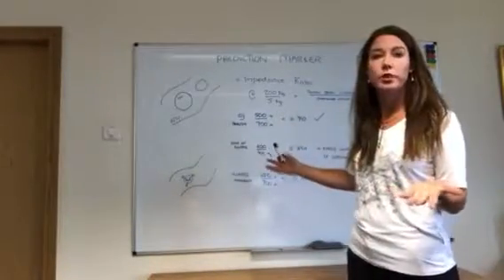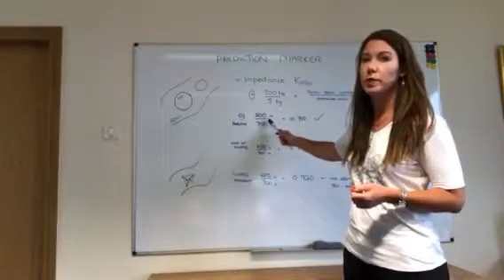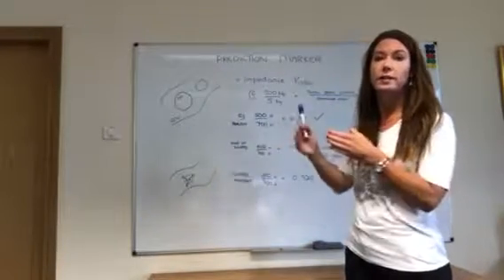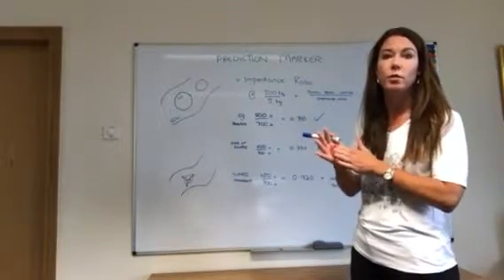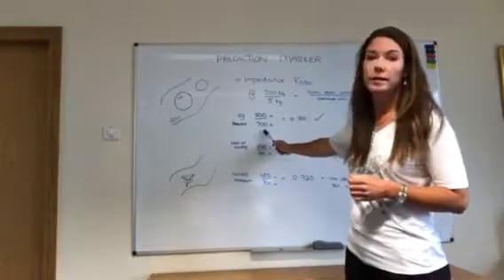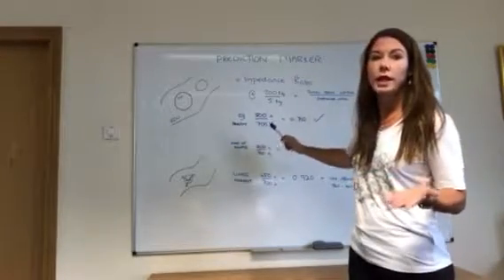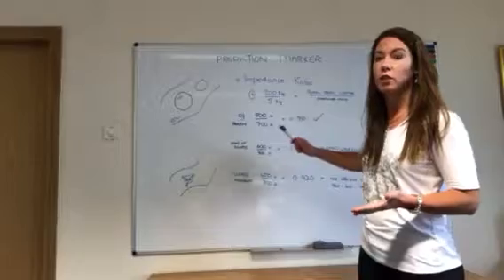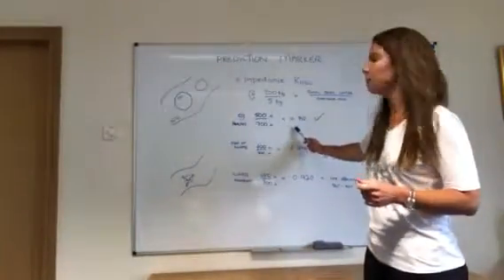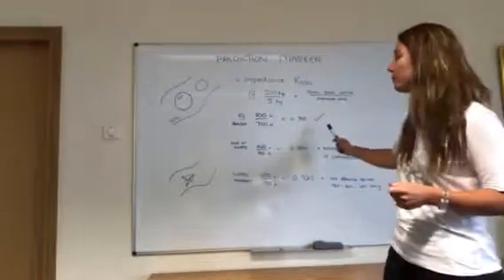For an example, just to show you how the figures work, the resistance can be 500 ohms at 200 kilohertz. Over at 5 kilohertz, where the resistance is quite high because the current is quite low, the impedance will be 700, for example. So 500 over 700 is quite a healthy impedance ratio at those frequencies. So for example, we'll come to 0.710, which is a healthy prediction marker.